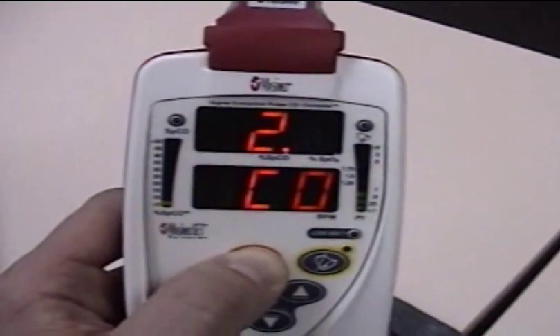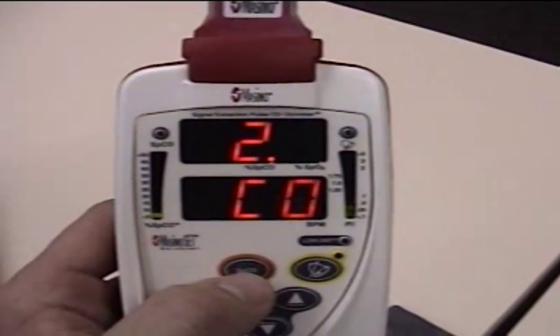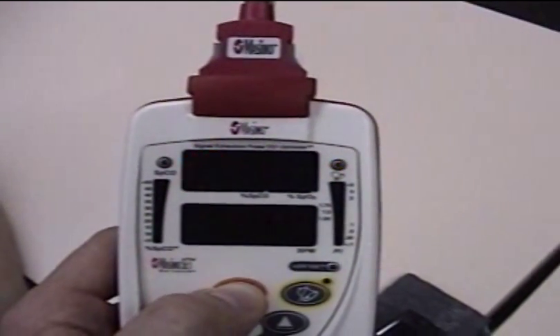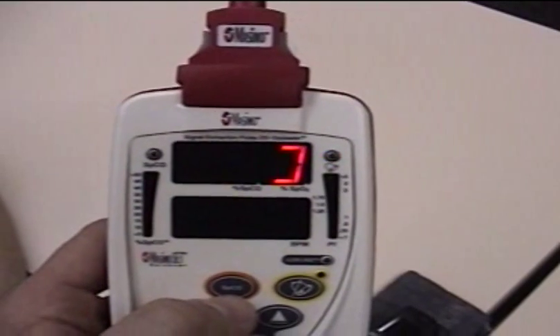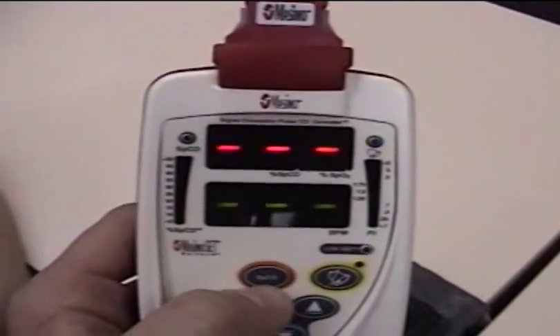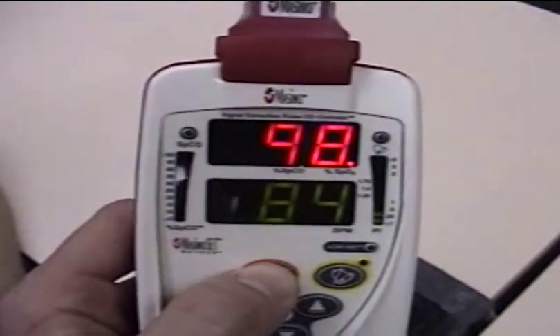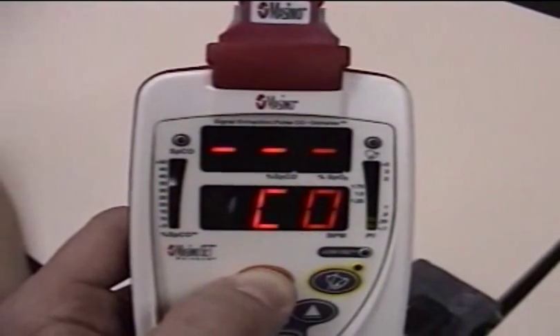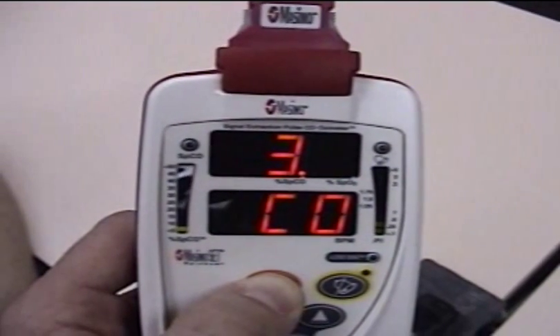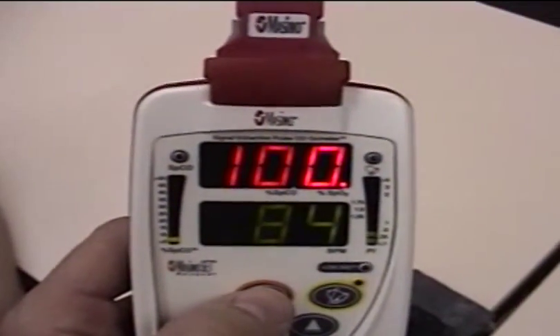CO is at two — so that didn't affect it either. This is the CO with black, and the black also has a sealer. CO is at two, three. It hasn't affected the color there.